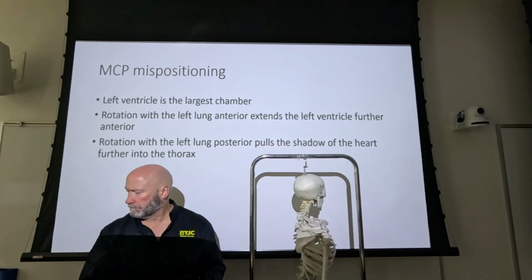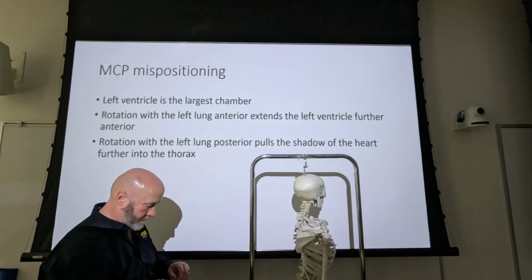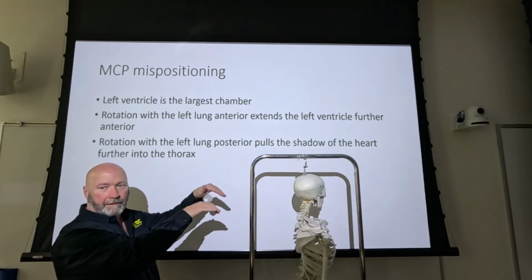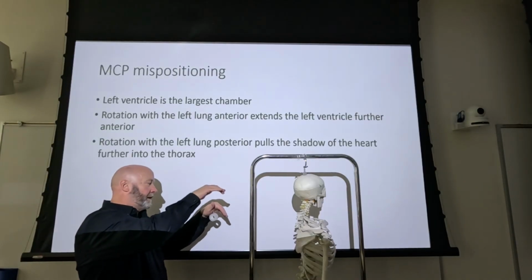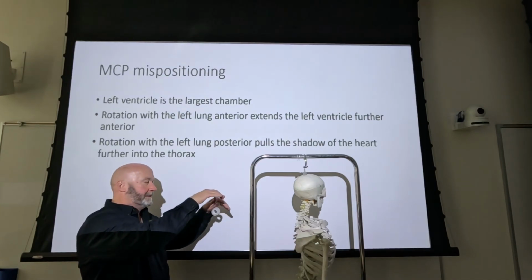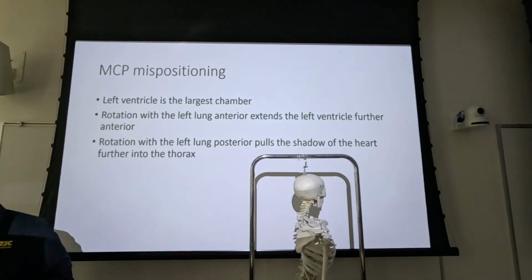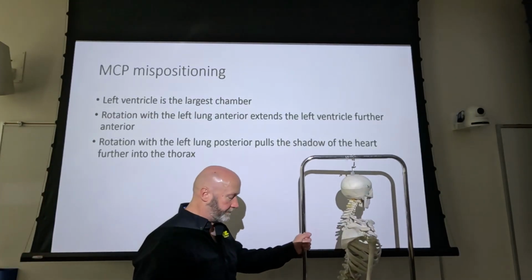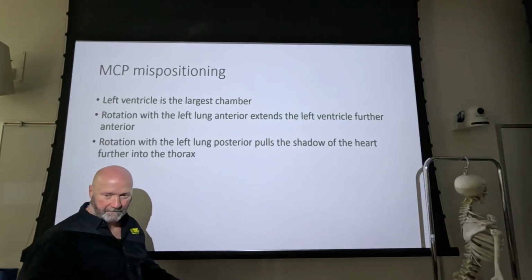So if your gastric bubble is above one hemidiaphragm, then which way was the patient leaning? Towards the middle. It elevated, so they're leaning away from the image receptor, right? If your diaphragms are not superimposed, one's elevated and one's depressed, then the one closest to the image receptor is, I mean, the patient's leaning towards the image receptor, okay? And you're probably going to know that just based on the shape of the patient. And you should see that coming really before you make your exposure. You position the patient, you take a look at them, and if they're doing this number, just tell them to straighten up.